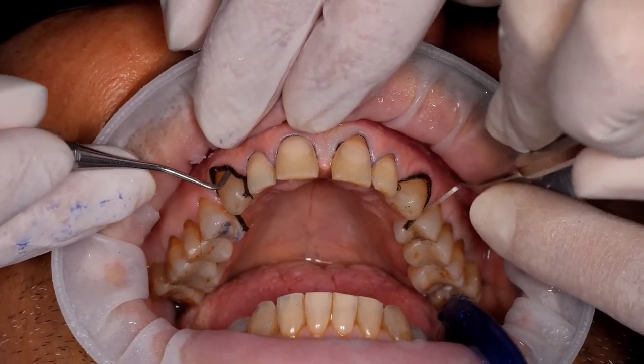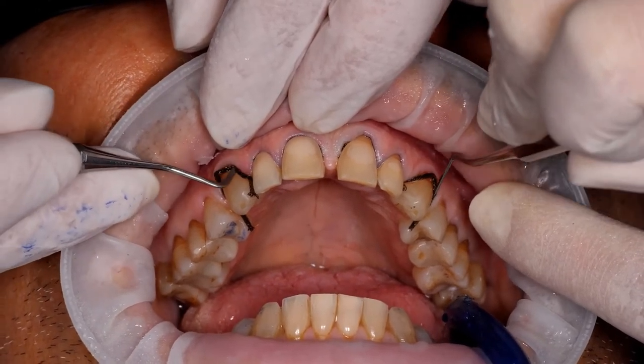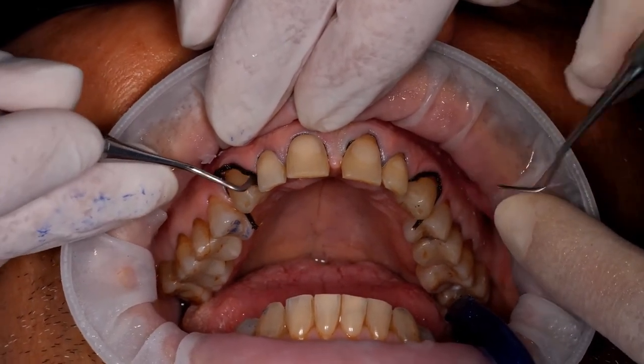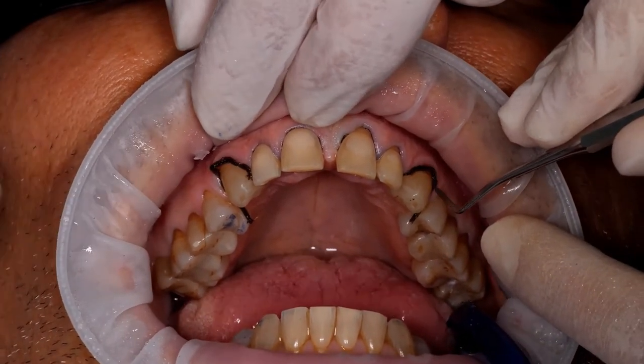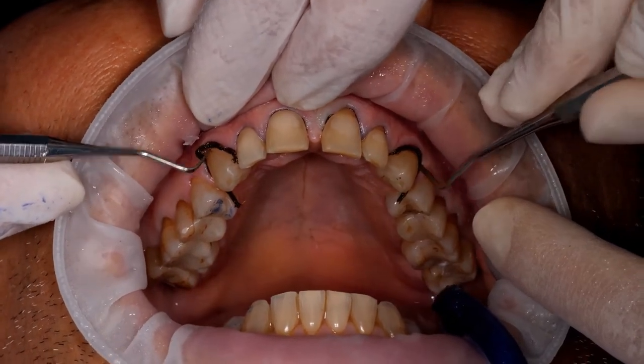Dr. Fredani, here in the molar we have a minimal sulcus, so it's difficult even to place the cords on the surface. Clearly, you mustn't push them in — you must place them very lightly. And if they won't get in, leave them outside. The cord is used just as a hemostatic, not to expand the sulcus.